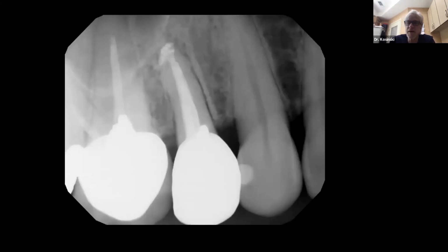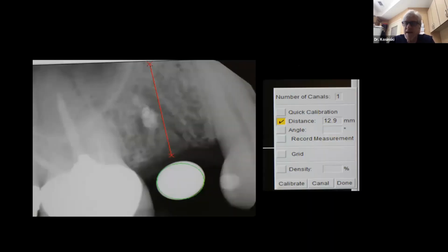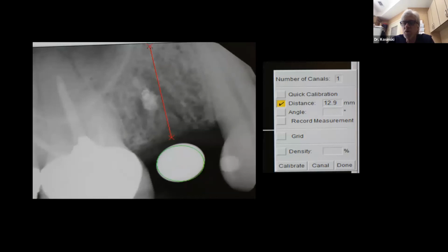Here we have a case, a tooth that is deemed non-restorable, probably a vertical fracture, mobile and symptomatic. We happen to remove this tooth and I grafted it, okay? And after a period of time, we determine, okay, it's time for us to place a dental implant. And we can do a grafting webinar at another date, another time, Damon, if you like.